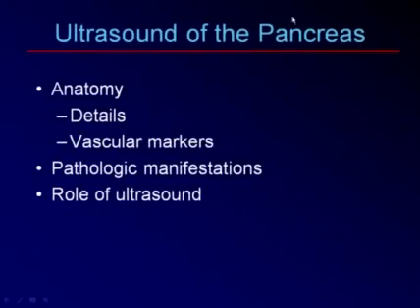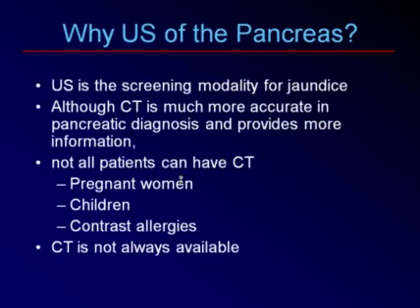First, I'd like to talk about the pancreas. I'd like to review the anatomy, some details, and highlight the vascular markers for the gland. Then we'll talk about some pathologic manifestations and the role of ultrasound.